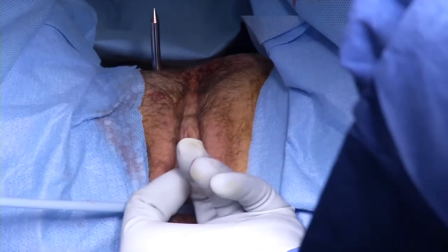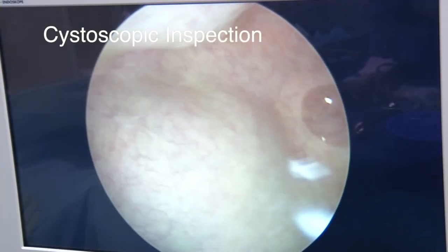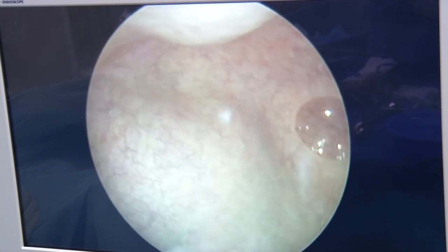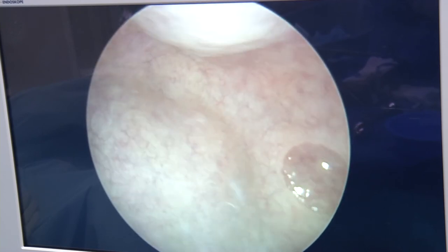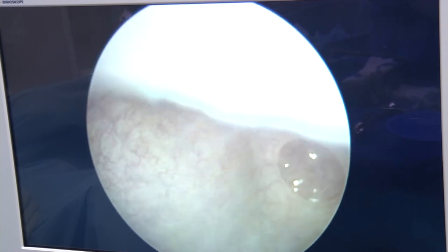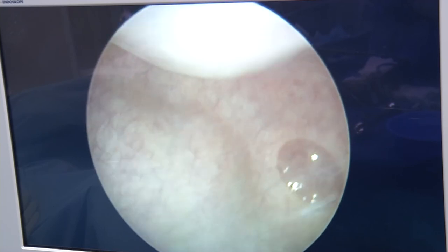Care is taken to inspect the vaginal wall to ensure no buttonholing was created. The rigid cystoscope with the 70 degree lens is then inserted to confirm there is no perforation of the bladder. It is important to make sure that the bladder is well distended. We can see that the trocar easily rolls back and forth, confirming the trocar has not skied the detrusor muscle or perforated the bladder mucosa. We also inspect the urethra with a 30 degree lens, and the bladder is drained before removing the cystoscope.